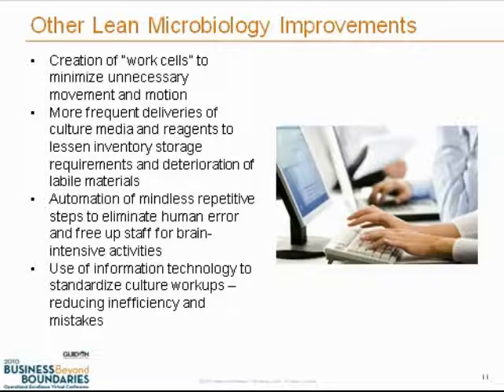Another recommendation that we have taken into account is automation of mindless, repetitive steps to eliminate human error and free up the staff that was doing that activity to perform more brain-intensive activities that take advantage of their skill and knowledge of microbiology.